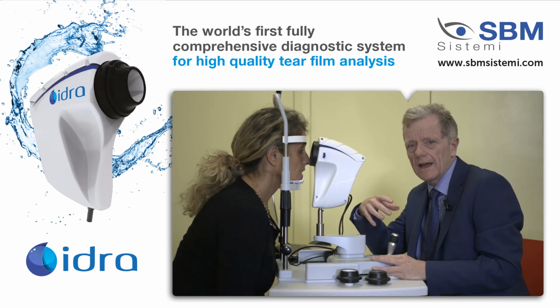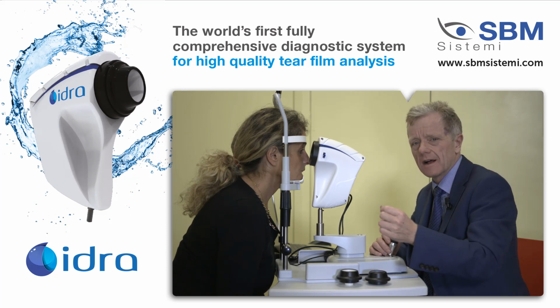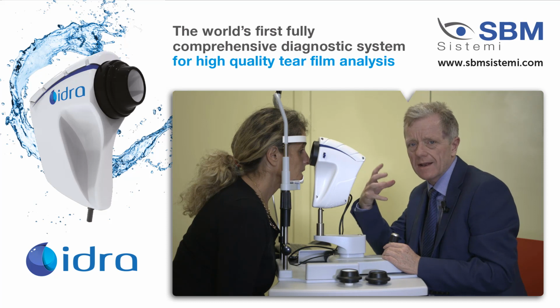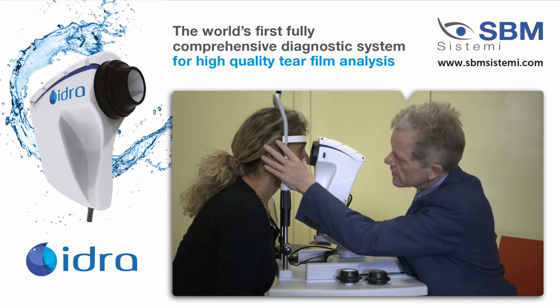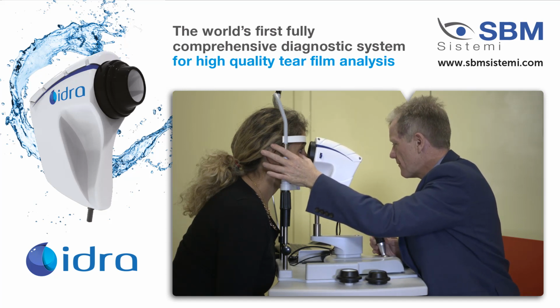So interestingly, we have one of the key metrics, the key ways of measuring quality of tears, and that's actually the source, the meibomian glands. So using infrared light, we can actually image the meibomian glands. We just simply have to hold the bottom lid and put a little bit of pressure to actually avert the lid a little bit, and then just take an image.